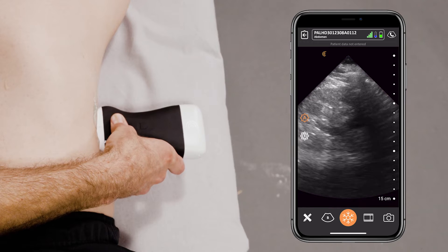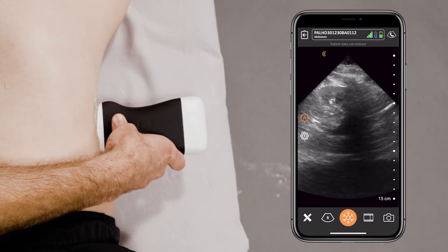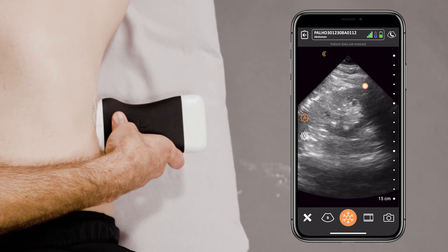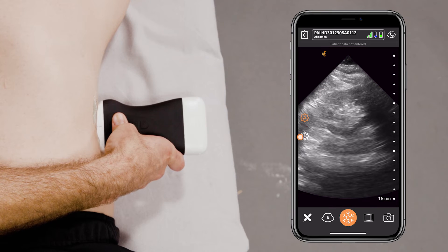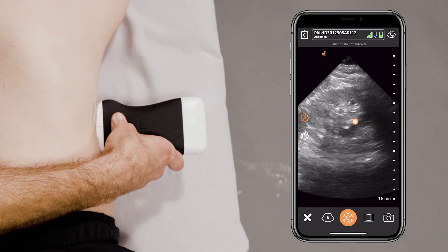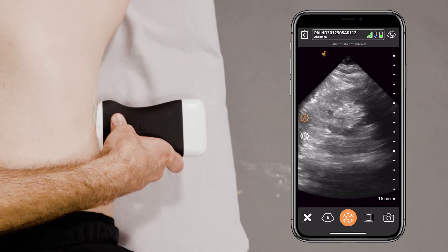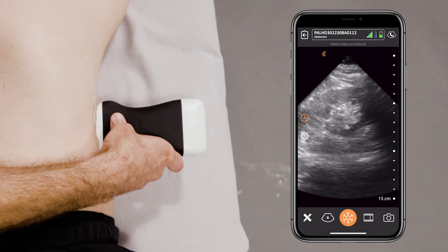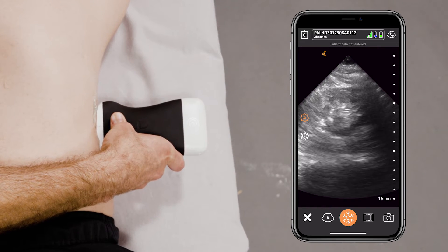It's a very nice kidney. We can change the depth if we want to get a really good shot of it. There's some rib artifact we're seeing, but you're seeing the renal cortex. And that bright stuff in the middle is actually the renal pelvis. That's really important because that's what you're actually focusing on — you want to see bright hyperechoic structures in the renal pelvis. If it's hypoechoic or dark, that's concerning for hydronephrosis.